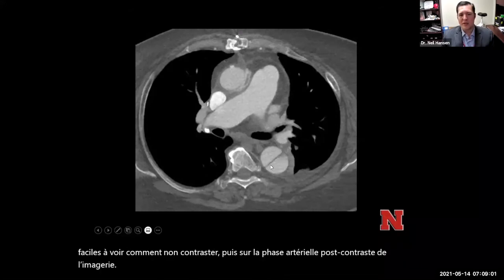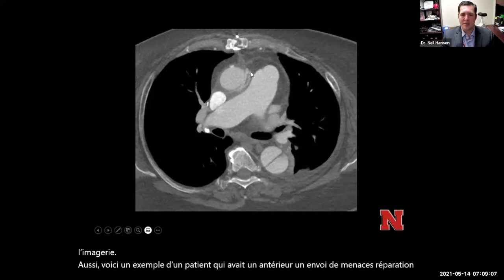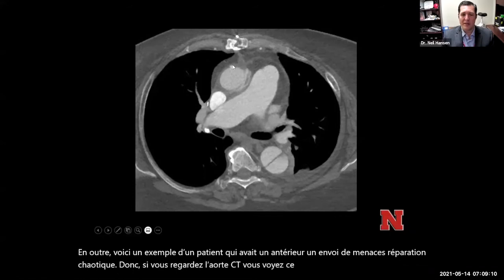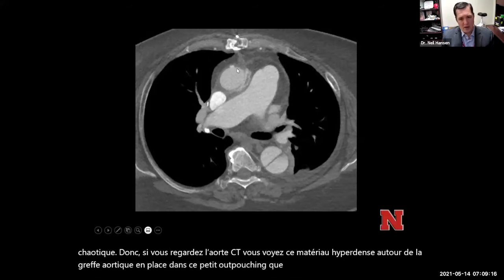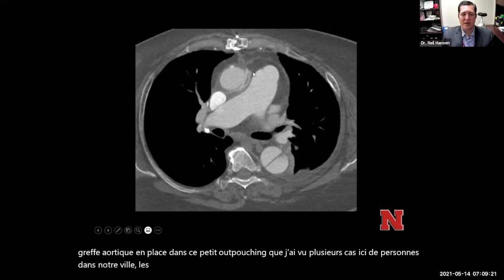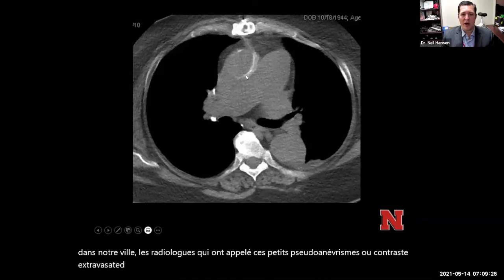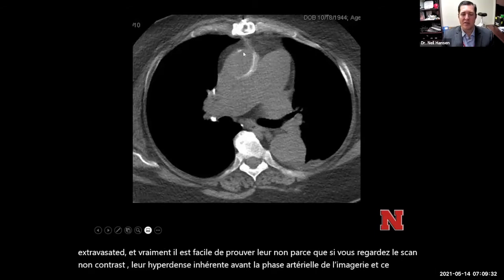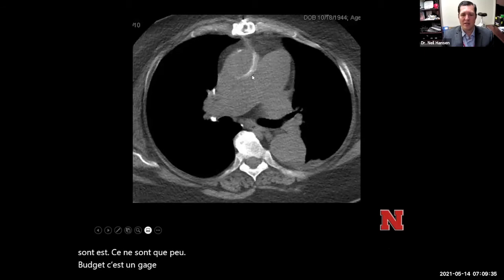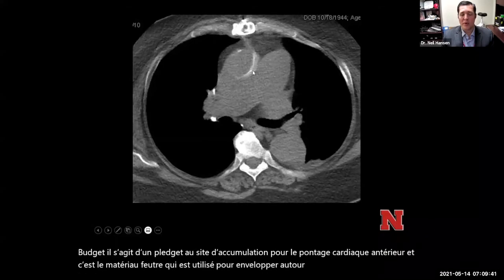Here's an example of a patient with a prior ascending thoracic aortic repair. On the aorta CT, you see hyperdense material around the aortic graft and a small outpouching. I've seen several cases where radiologists have called these small pseudoaneurysms or extravasated contrast. It's easy to prove they're not, because on the non-contrast scan they're inherently hyperdense prior to the arterial phase. What they are is just little pledgets — felt material used to wrap around the graft at a cannulation site for prior cardiac bypass. It's a normal post-operative finding.